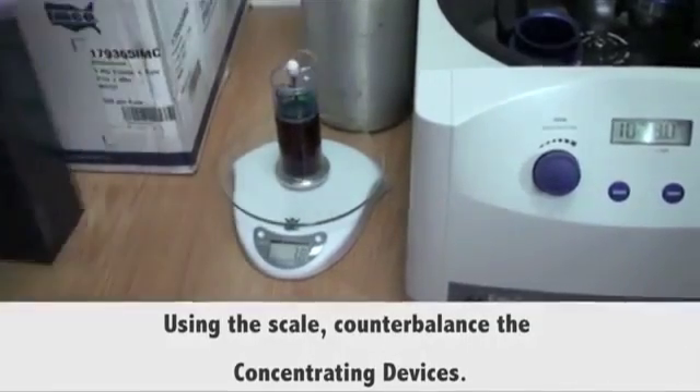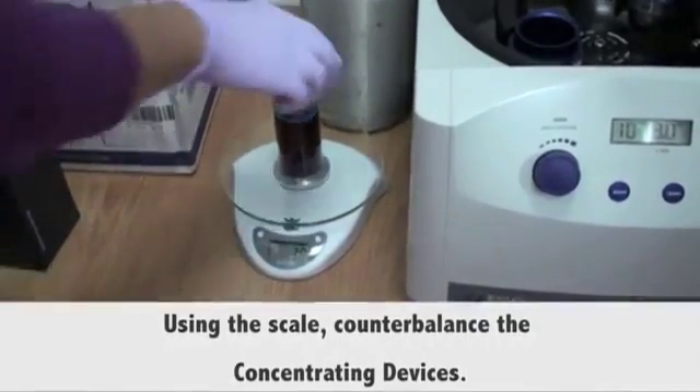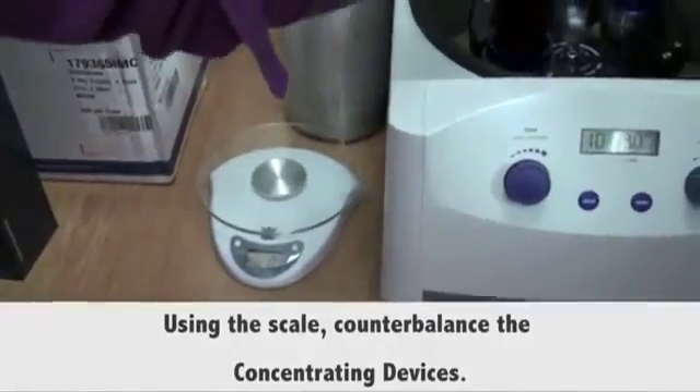Then place the devices in the centrifuge buckets at opposite ends, and close the lid.